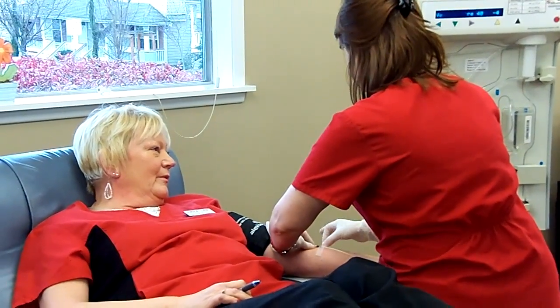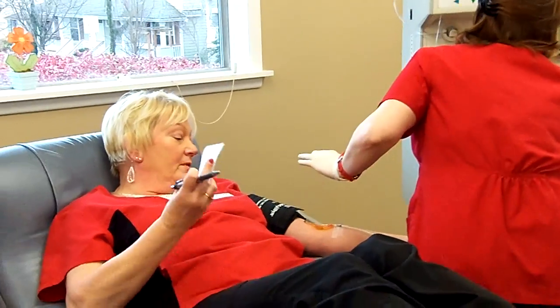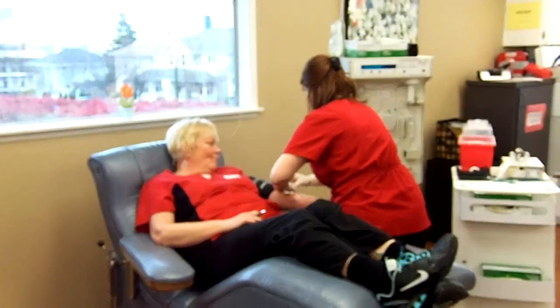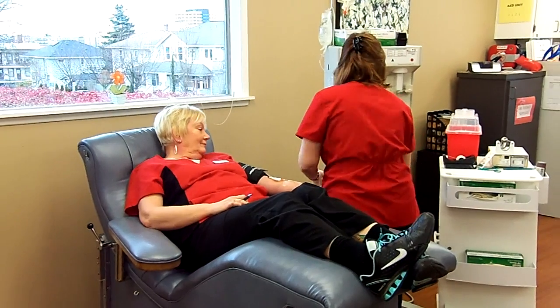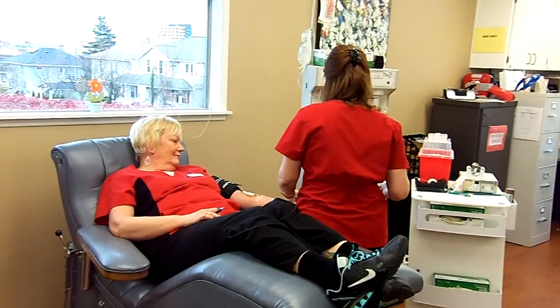I call my people sharpshooters. Very good — I'm very, very good at a lot of this. You want to keep that area very sterile, so you keep that covered at all times. At this point, you're just going to make a connection between the arm and the machine.